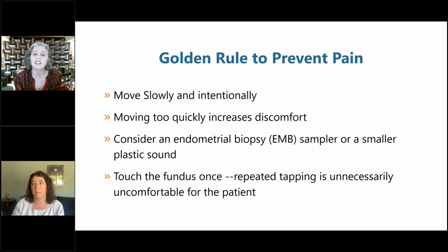And when we talk about slowly, it's not that the entire procedure will take more than 30 seconds longer than it would have otherwise. It's really not going to add a lot of time. It's just a slow, intentional, calm movement instead of something where it's going boom, boom, boom.